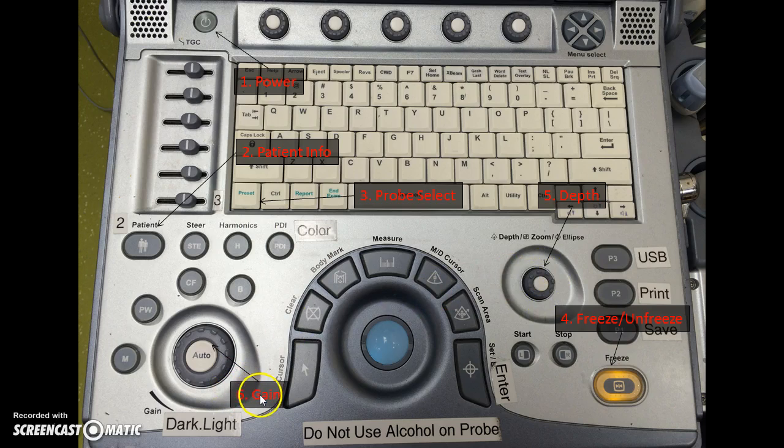And then lastly is your gain. And I think that there's two different ways that you can do the gain. Again, using these here adjusts gain at different levels of your image, but using this one adjusts gain of the entire image. And you can actually click on this auto button to optimize your image fully.